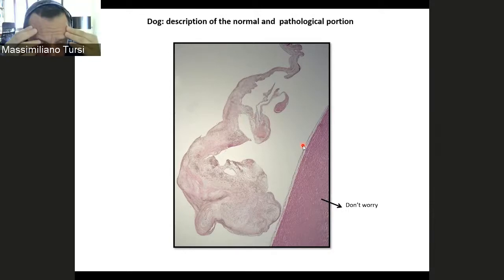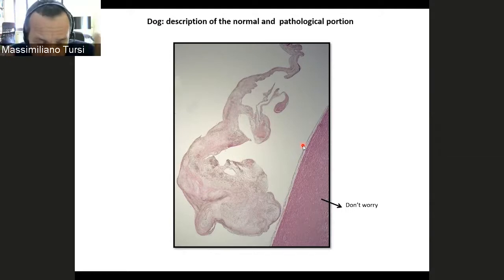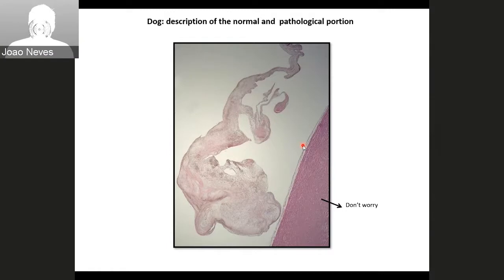Why is it not possible at the histological examination? Because it's very hard to put all the chordae tendineae in the same slide, between the leaflet and the papillary muscle. Come on, it's very difficult. Also because the chordae tendineae is a branching structure. I think it's almost impossible. No, I understand that. It makes complete sense. It's just to make sure that we shouldn't comment on that. That's fine. Thank you. Maybe I can ask it to you for the examination.